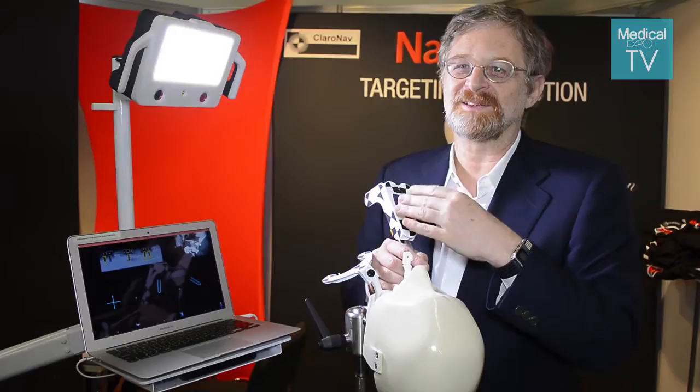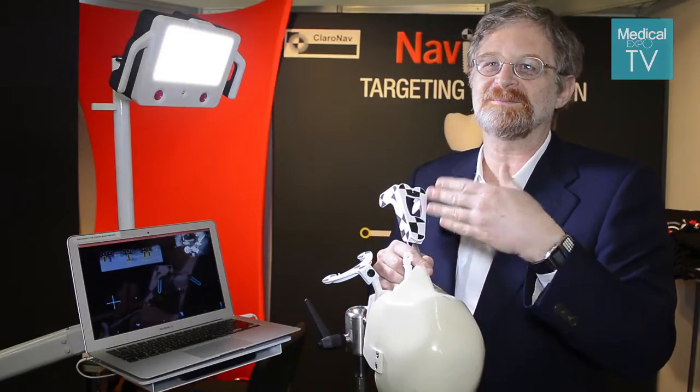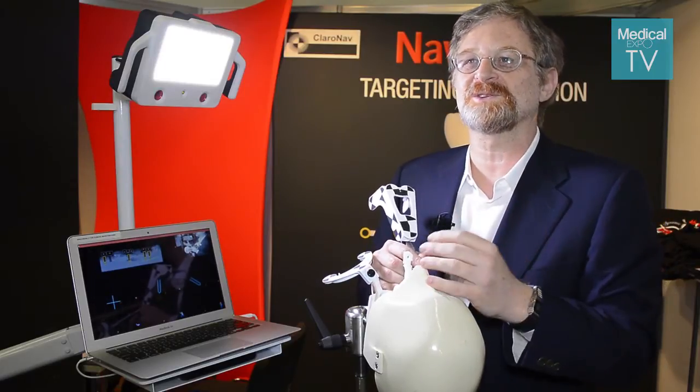Overall, the system allows the surgery to be done with less chair time, less preparation time, less swelling, less medication the patient has to take, and the result is much better.